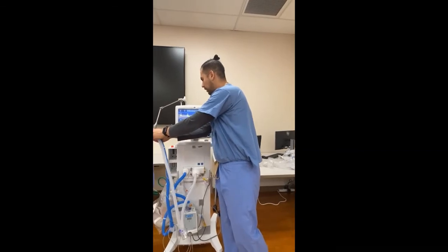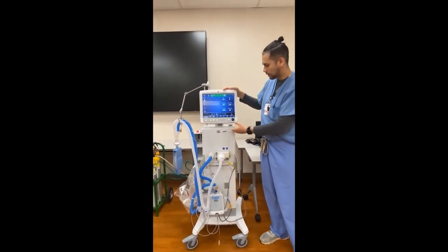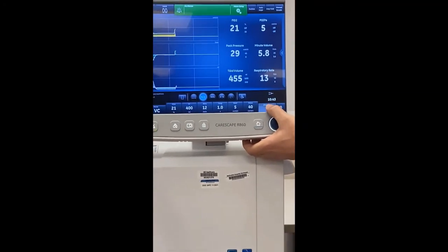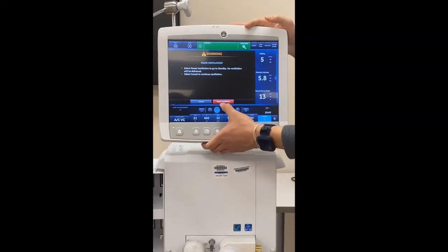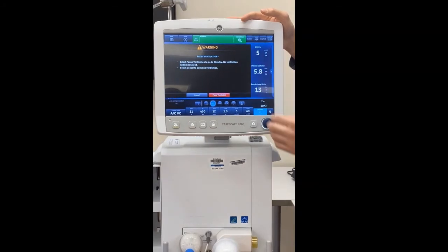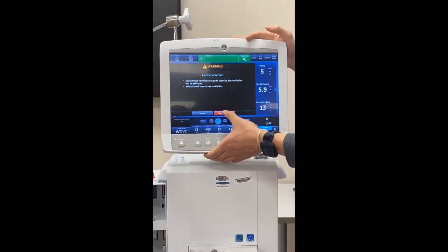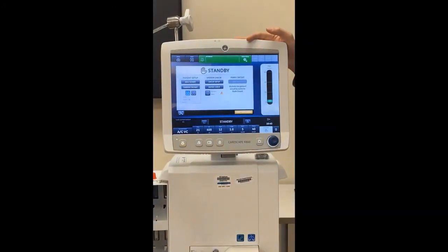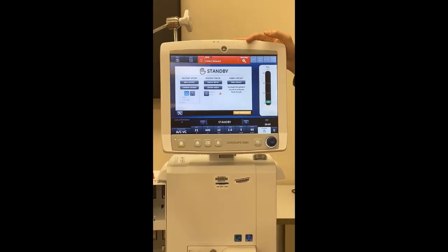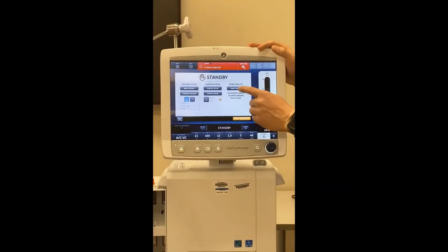This ventilator is very sophisticated. We do have a standby button here, in which if we press standby, it will put the ventilator on a pause ventilation. We do so by clicking standby, and we will get another warning screen asking if we for sure want to put the patient on standby mode. We then pause the ventilation, and the ventilator is not providing those tidal volumes. It will ring because the patient is still connected to the ET tube, so we want to park it.